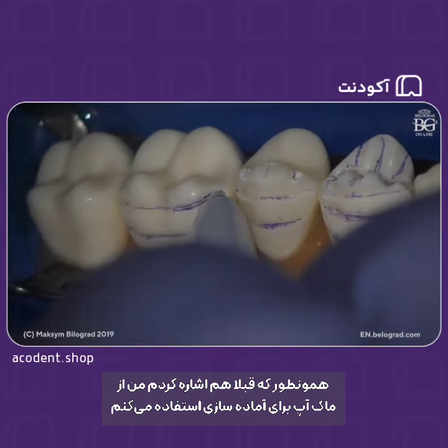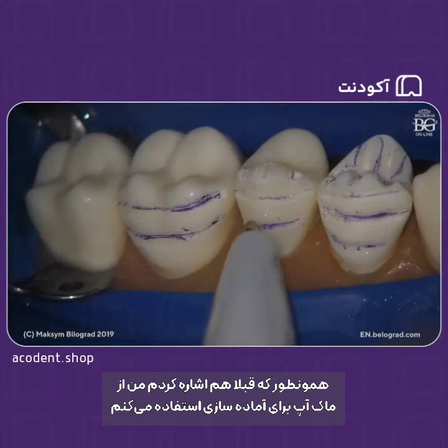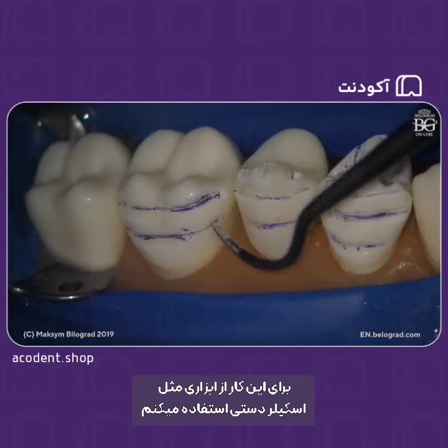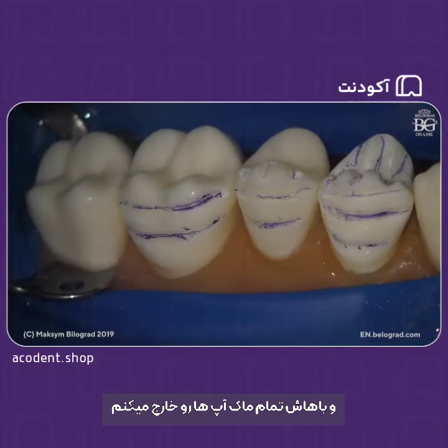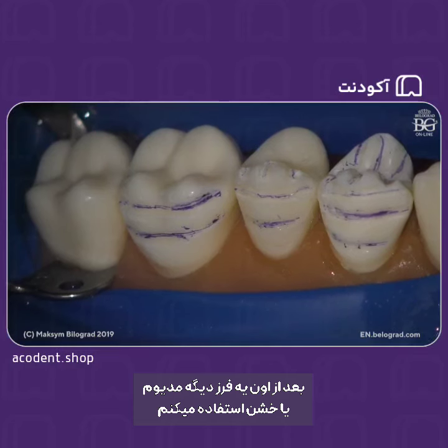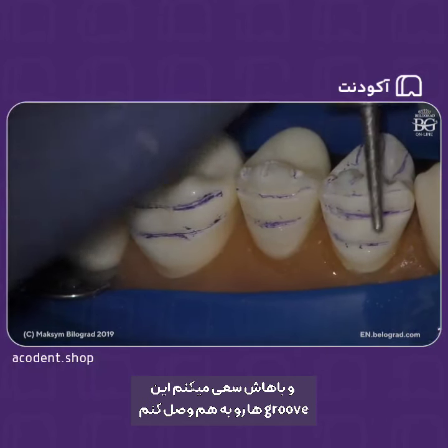As I mentioned before, we're using mock-ups for preparation as well. Okay, so what I'm trying to say is that after you mark everything as you see here, I would remove the mock-up. I will take some instrument like this one. This is a hand scaler, and I will just take out all this mock-up, and I will be able to see where I reach the tooth surface. Okay, and after that I will just take another burr, medium grit or coarse, and I will start to join these grooves.